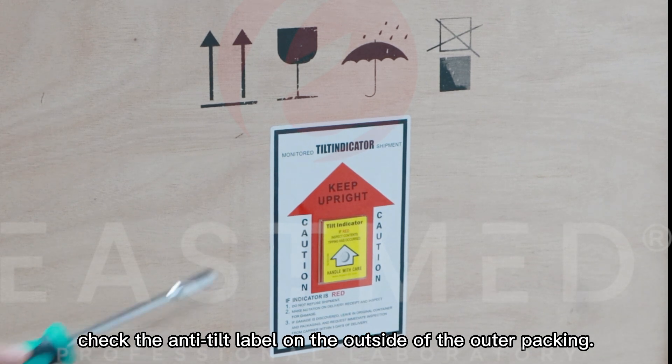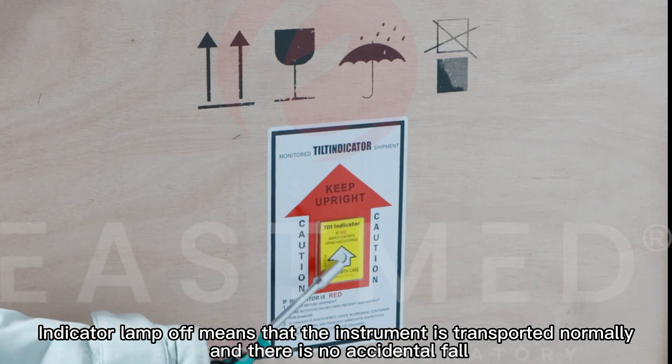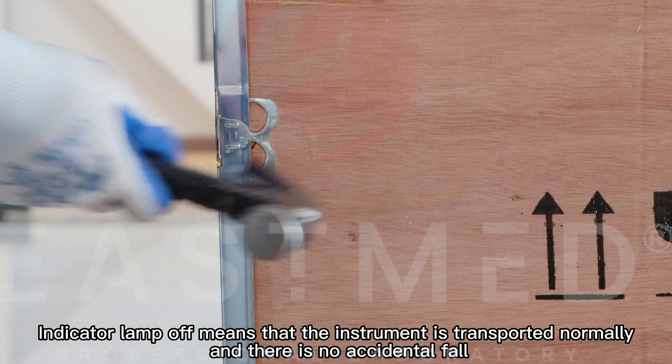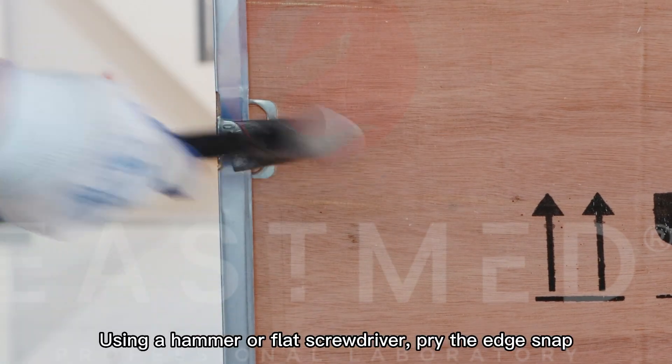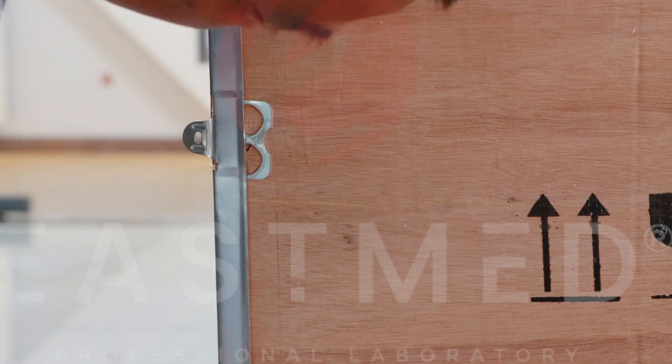Check the anti-tilt label on the outside of the outer packing. Indicator lamp off means that the instrument was transported normally and there was no accidental fall. Using a hammer or flat screwdriver, pry the edge snap. At least two people are needed to assist.